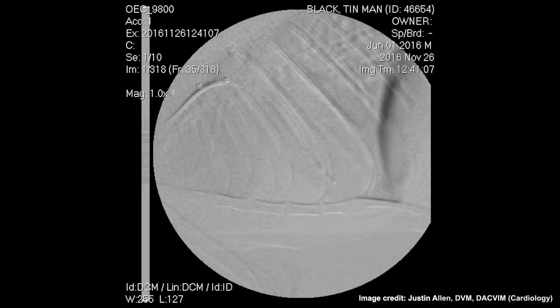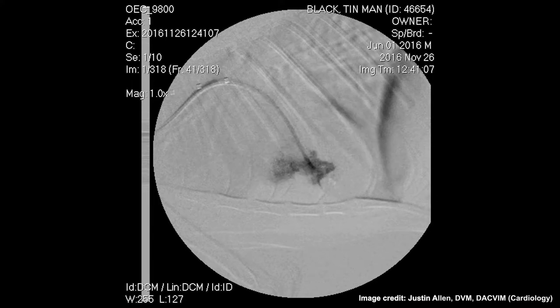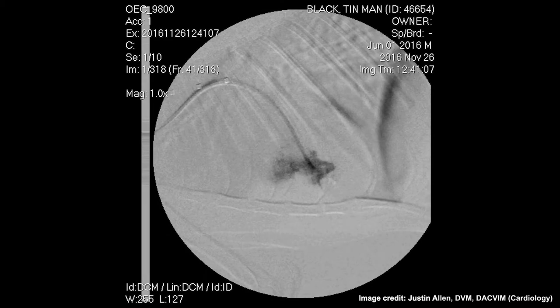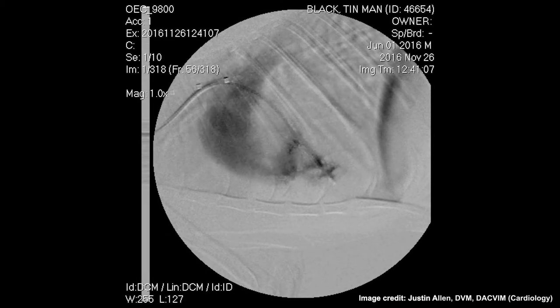Next, the cardiologist injects contrast into the right ventricle, present here in black. We can identify an area inside of the right ventricle that is not filled with contrast. This happened because of an irregular hypertrophy on the right ventricle in that specific region. The contrast is quickly pumped into the pulmonary trunk, which is dilated.